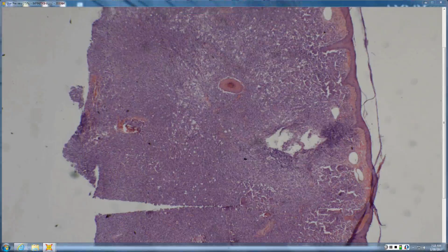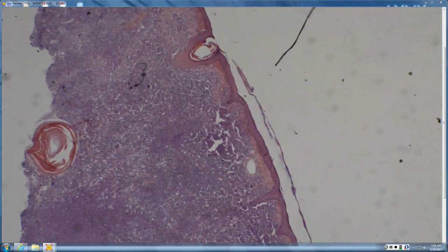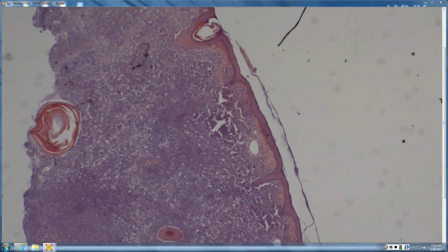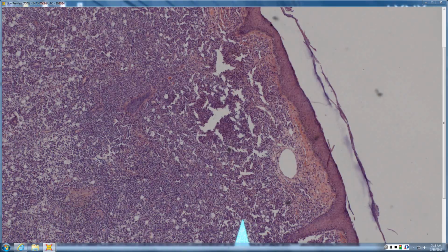Okay, number 10, this is Rhinoscleroma. From scan, there's usually just this pronounced diffuse infiltrate. And for whatever reason, Rhinoscleroma in particular often forms these sort of crack-like spaces, and that can be a clue. You can see that in other things too, where it's just chock full of inflammatory cells. But it does seem to go fairly well with Rhinoscleroma.